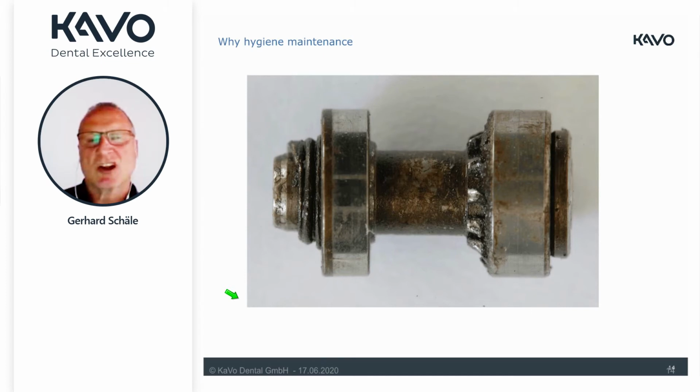This is not only a question of the mechanical problems which could occur, this is also the question of whether this instrument is really sterilized when leaving the autoclave, or could there be some living organisms underneath the different dirt layers? This is the reason why the Robert Koch Institute says clearly only clean instruments, so that we do not have dirt layers in the instrument and give maybe some viruses the chance to survive the autoclaving.